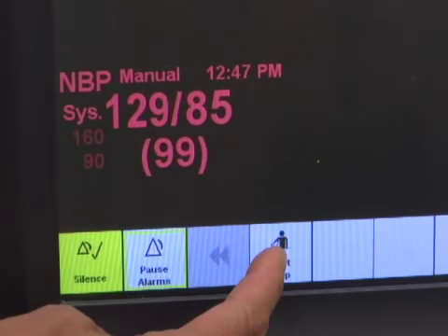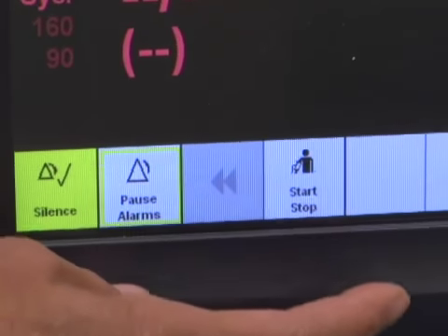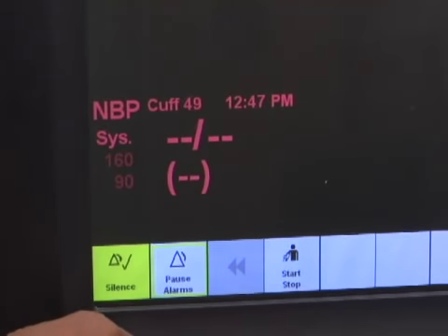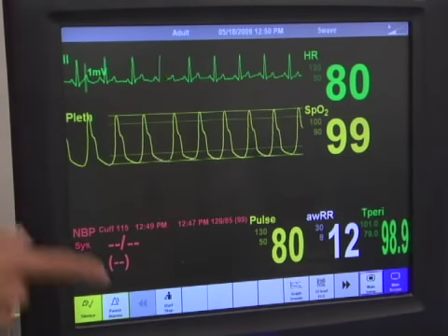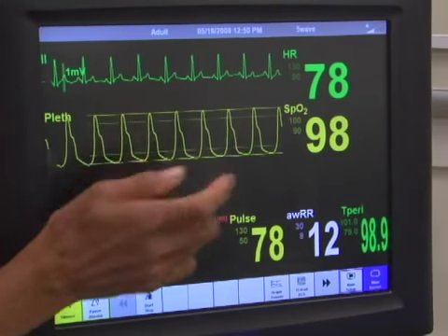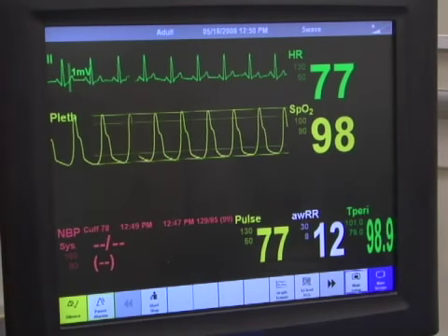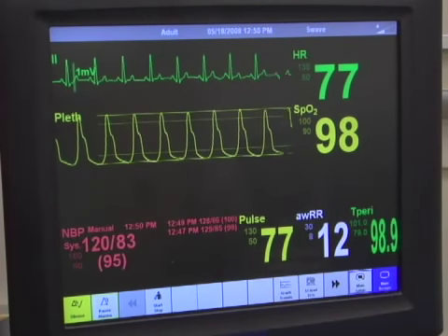The blood pressure is obtained by selecting the icon on the bottom of the monitor that indicates BP, similar to the electronic BP machines found in hospitals. The values of HR, RR, and O2 saturation are dynamic. In other words, they change with the patient's condition, whereas the BP reading is reflective of the value at the last assessment. The student must select the icon to obtain updated BP values.